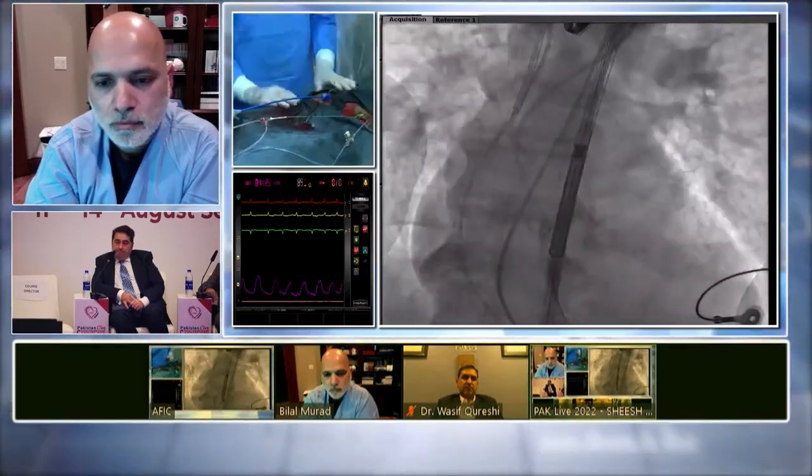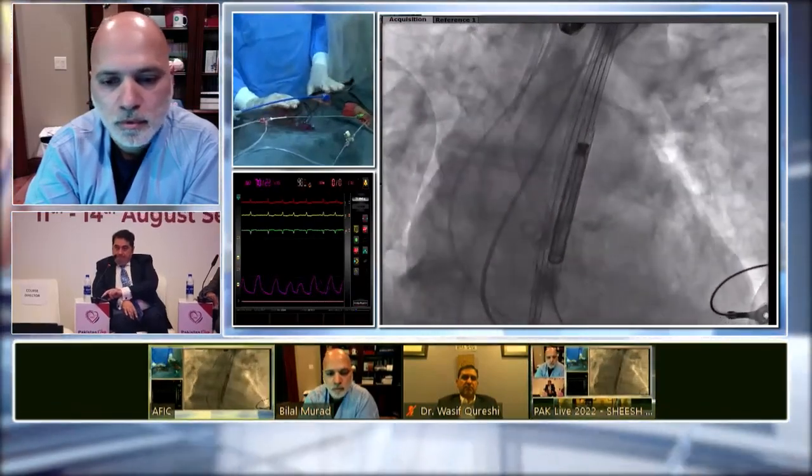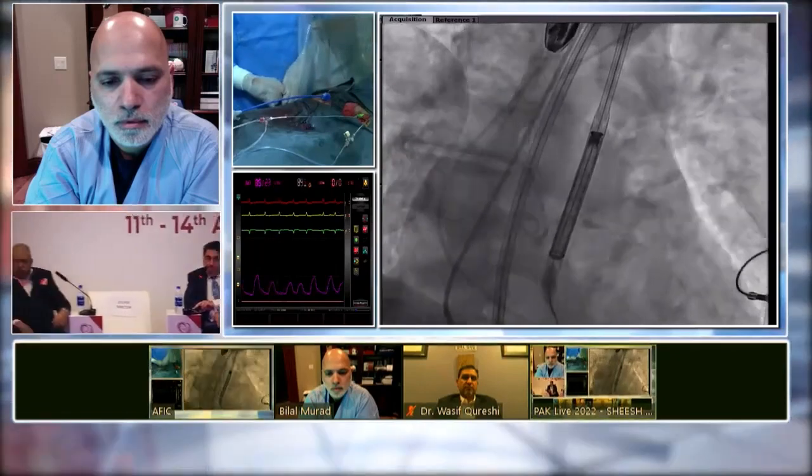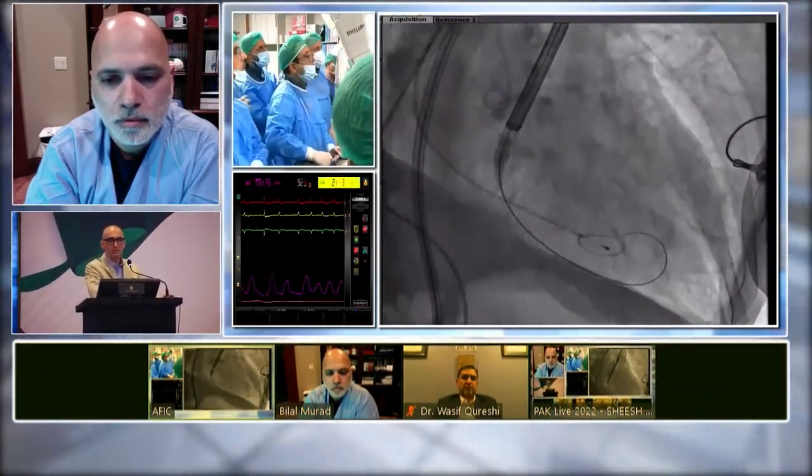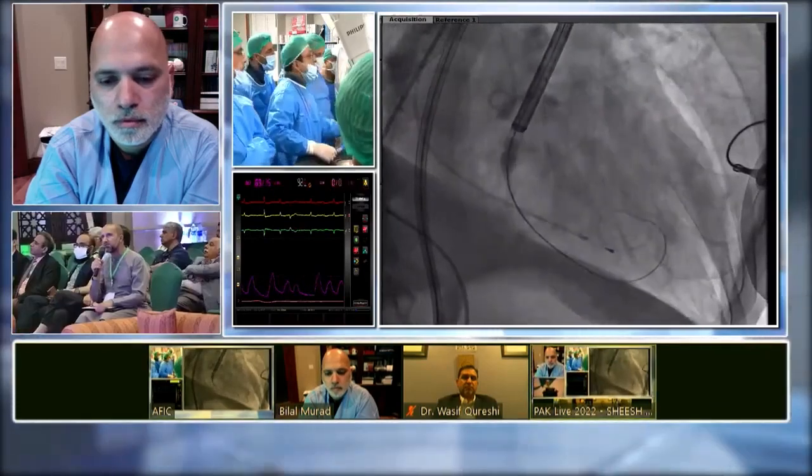Hello, it's Asad from Peshawar. So they have the valve. What about the state of the Sentinel devices? Have you used them, and what are the indications? When will you use them? The Sentinel stroke prevention devices in TAVI procedures.